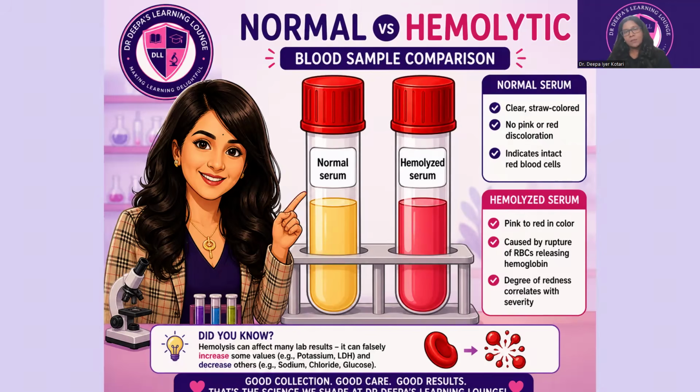It is when you have a sample which is more pinkish than usual on your serums, or when you have darker CBC samples that you doubt are hemolyzed. And these days, when the sector is more B2B than B2C, there is an increased quantity of hemolytic samples that would land with you. It is very important to recognize these.